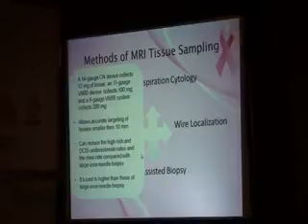collects 17 milligrams of tissue. An 11-gauge vacuum-assisted breast biopsy device collects 100, while a 9-gauge collects 200. It allows accurate targeting of lesions smaller than 10 millimeters and can reduce the high risk and DCIS underestimate rates and the miss rate compared with large core needle biopsy. However, its cost is higher than those with large core needle biopsy.